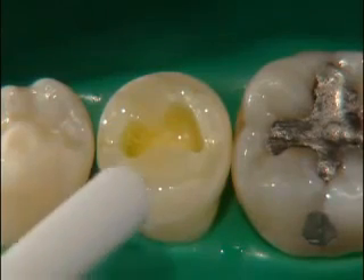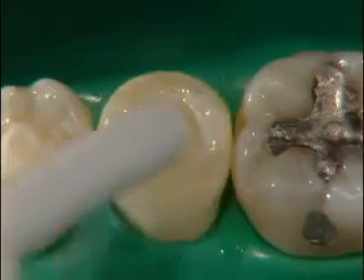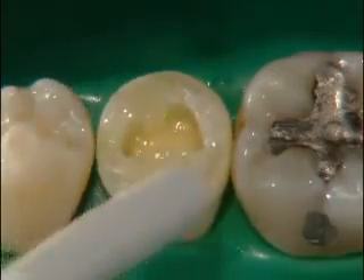Next, air-thin the liquid for approximately 5 seconds until the film no longer moves, indicating complete vaporization of the solvent.